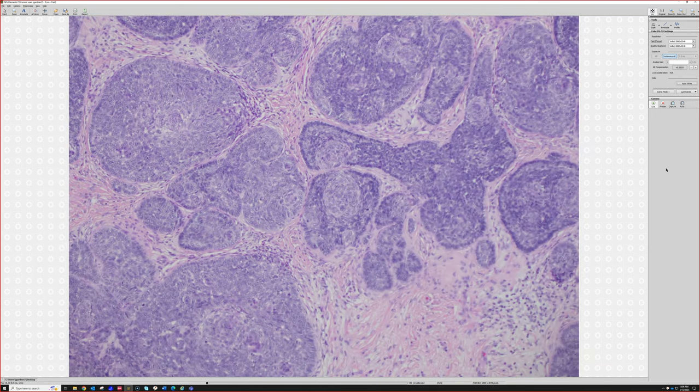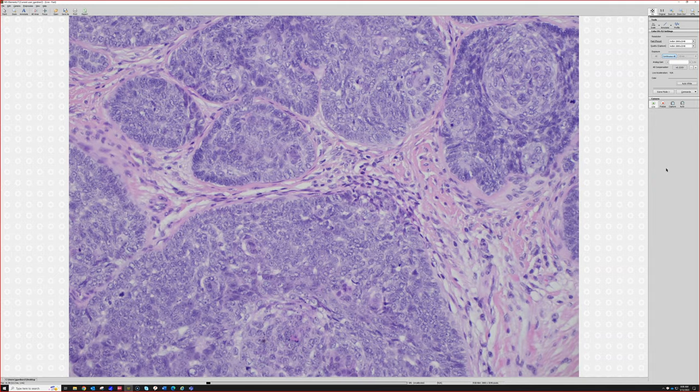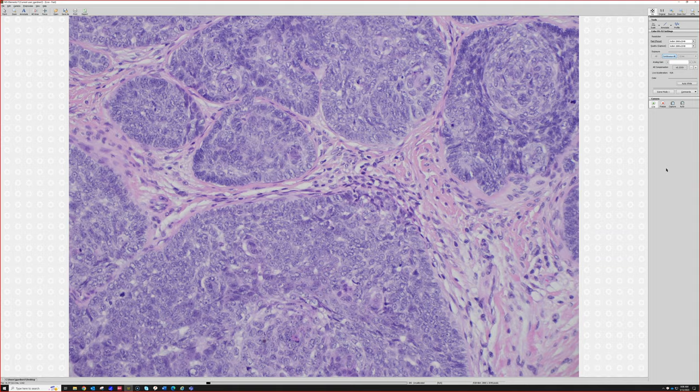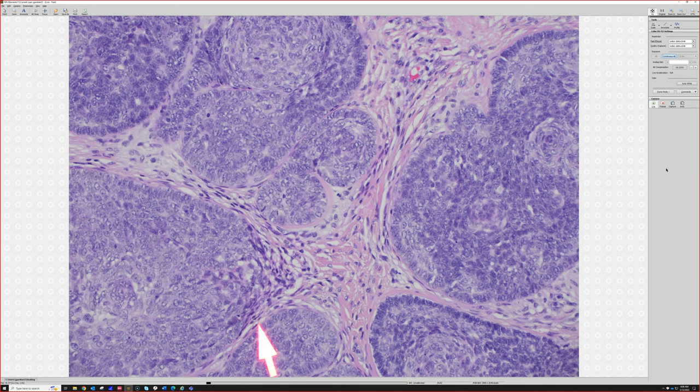But I do feel like you see them. Maybe I lied to you. Maybe I'm confusing this with another case. There's kind of ones here. They're not the best. This little cluster right here is a very primitive kind of papillary mesenchymal body. And if you guys are like, what? That does not look like one. I agree. It's not the best, but it is kind of on the spectrum of papillary mesenchymal body.